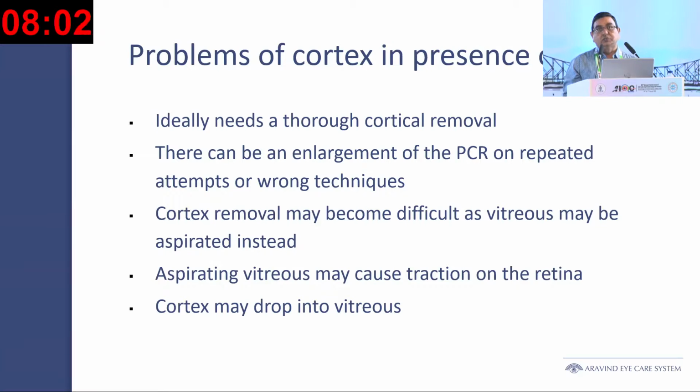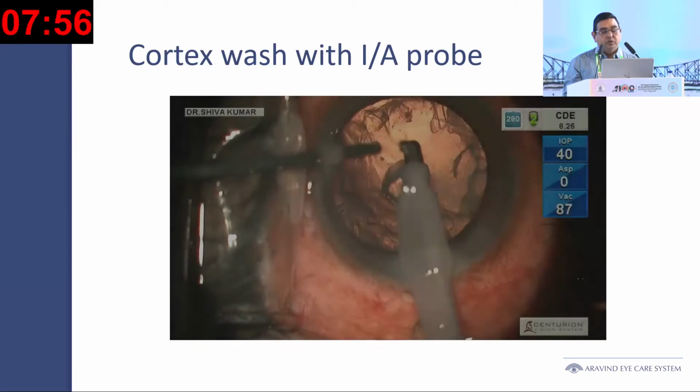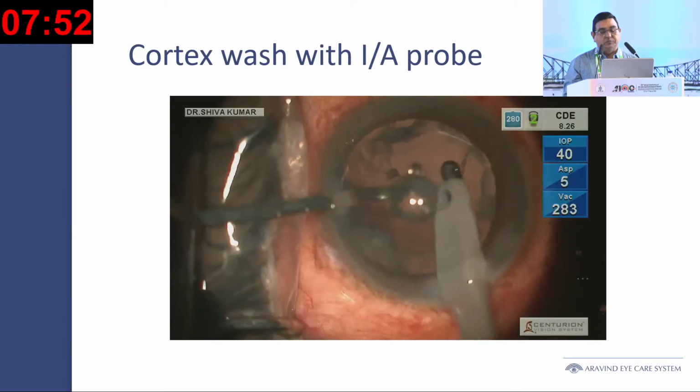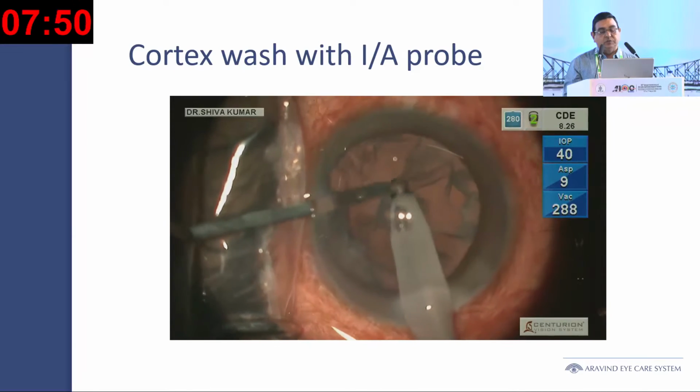So we look at some of the videos where we'll see some of the principles of cortical wash. So here I am not still sure, it's an opening which I see, it's a PCR. So what I'm doing is I'm stripping off the cortex.